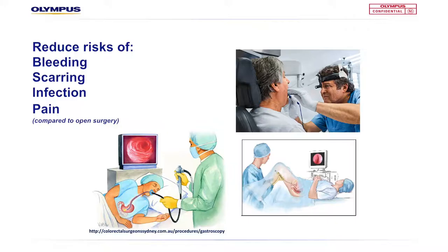But of course, these natural orifices are rarely in a straight line, and they are often delicate tissues and mucosas, such as the airway, nasal cavity, and the urethra.